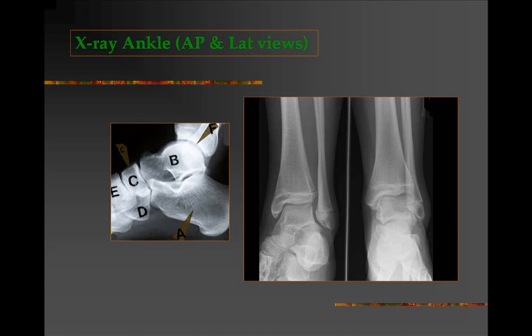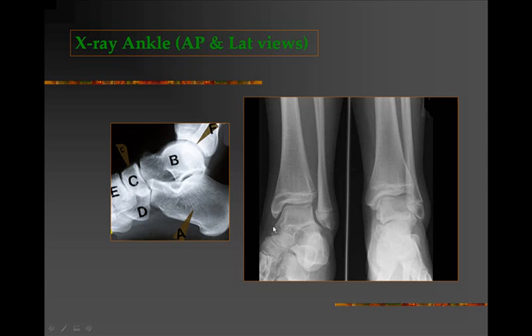Here we see x-rays of the ankle joint in AP and lateral views. The lateral view shows the ankle joint and subtalar joints, with the talus, calcaneum, navicular, cuneiform bones, and cuboid visible. The AP view of the ankle shows the medial malleolus and lateral malleolus clearly, as well as the talus, the true ankle joint, and inferiorly the subtalar joints.